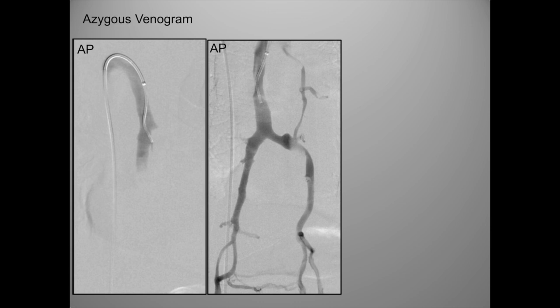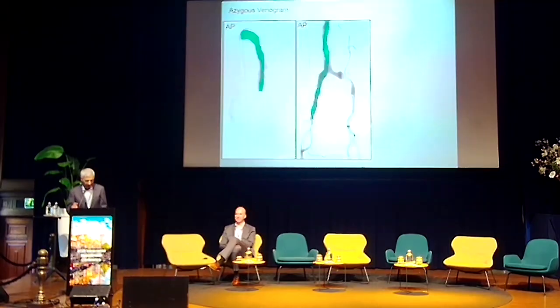Now, when surgeons like Marcus Bowder or Jurgen talk and show their intraoperative cases, to the non-surgeons, it all looks red and beige and variations of tan. And so we don't know what we're looking at really. I don't want this to be like this, and I hope I can clarify this. These are angiographic pictures. Hopefully it'll be clearer. Okay. This is the catheter in the azygos vein, and you see the azygos and hemiazygos, obviously green.